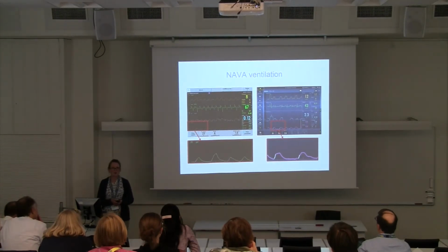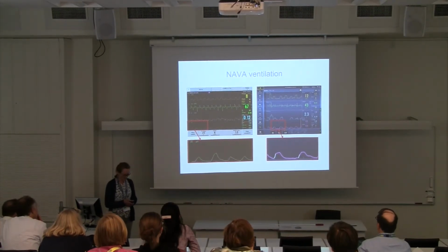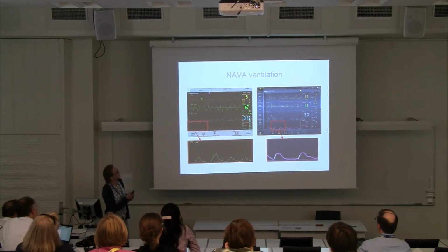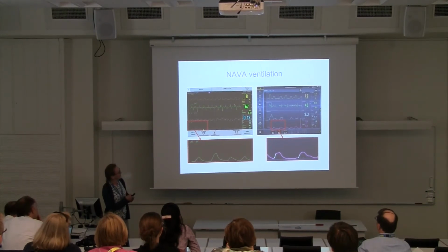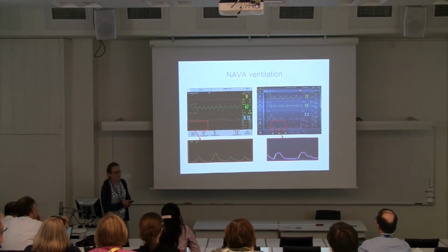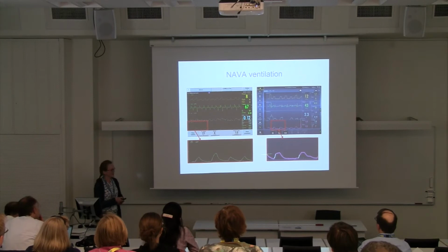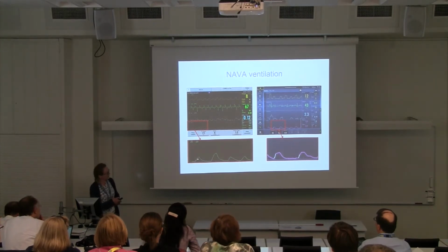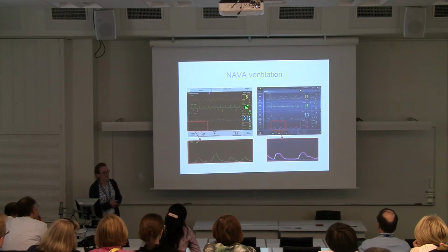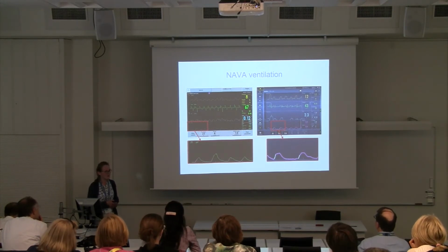So here these two babies are switched to NAVA ventilation. The upper curve is the pressure, flow, volume, and then here on the lowest panel, the EDI signal. And I made these signals a little bit bigger so that you can really see that on NAVA ventilation, the trigger comes from the EDI signal. You can see these different colors in the beginning of the breath.